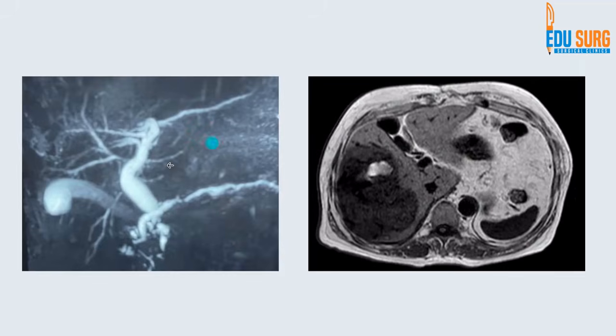Okay. Now, like I said, to increase the contrast of water, it is a heavily T2 weighted image, that is MRCP. Remember that MRCP has no injectable contrast. The water, or the hydrogen in the bile acts as contrast.